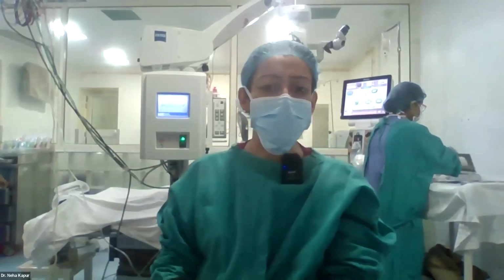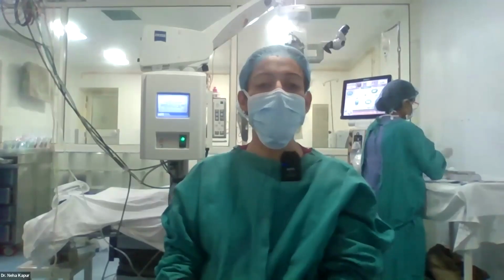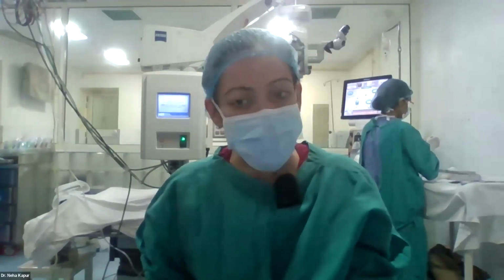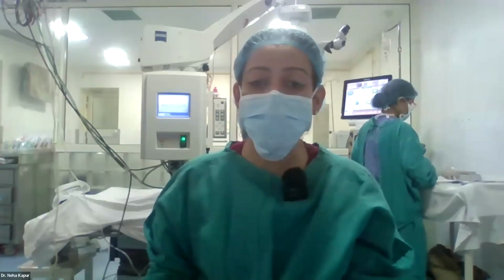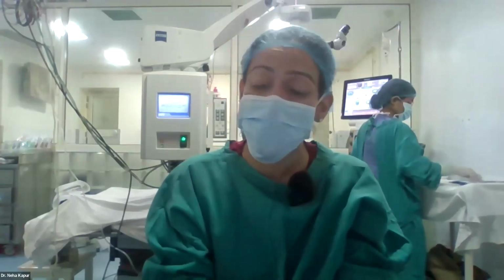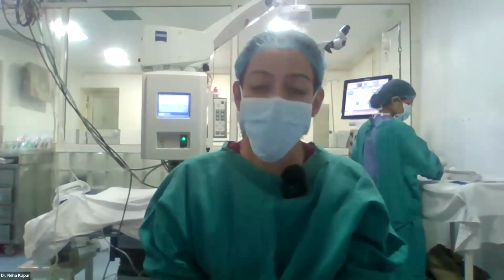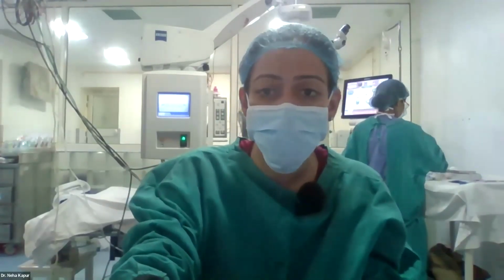Difference in the final outcomes and different techniques used to insert? Yes, there are differences in the various techniques used, but Sheets glide, Busin glide, and endoserter are absolutely reproducible techniques. Also it depends on the indication that you're using it for and personal surgeon choice, preference and experience. But all of them standalone, used again and again, are very reproducible techniques.